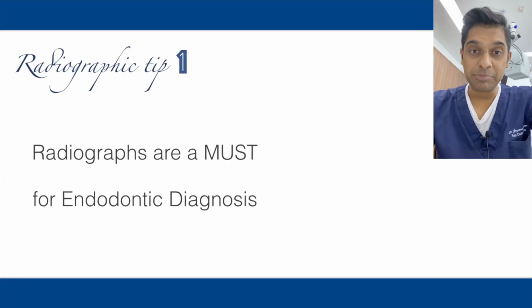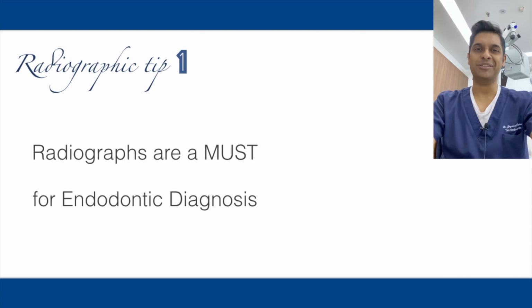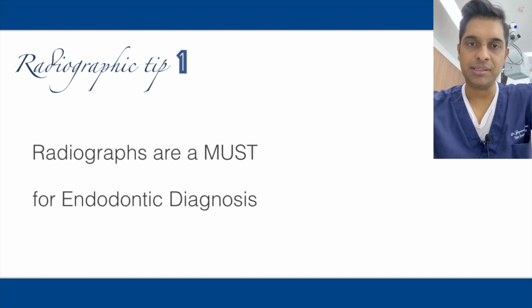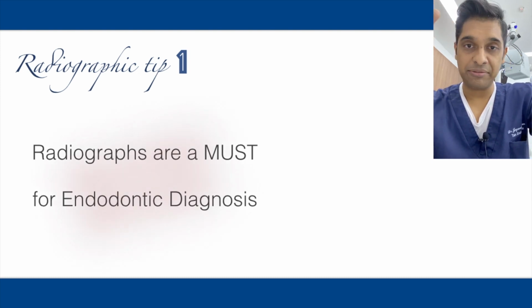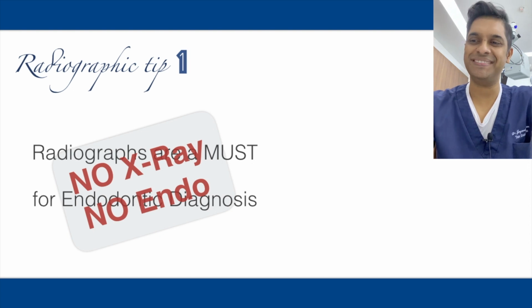To begin with, tip number 1: radiographs are a must for endodontic diagnosis. You should only conclude with a diagnosis after you have done your radiograph and done your interpretation. If you don't have x-rays, then there is no endo.